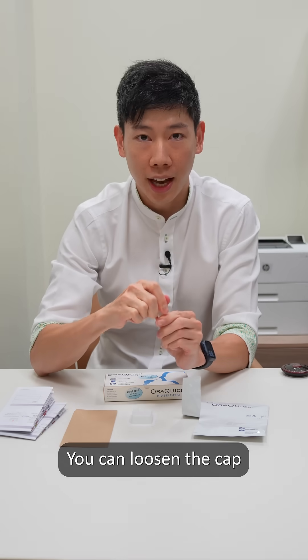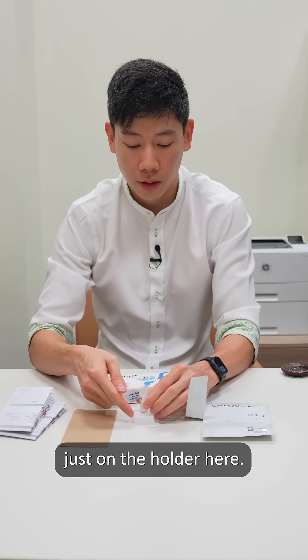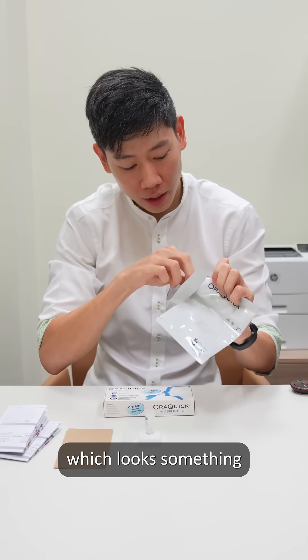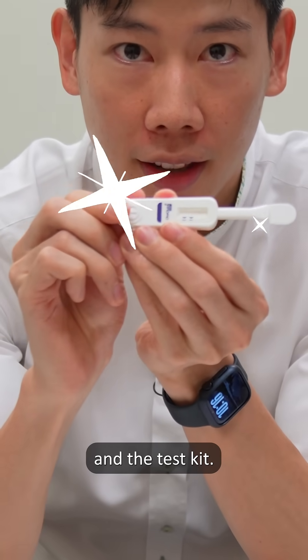You can loosen the cap and place it on the holder just here. Now you open the top pouch, which looks something like this, with both the swab and the test kit.